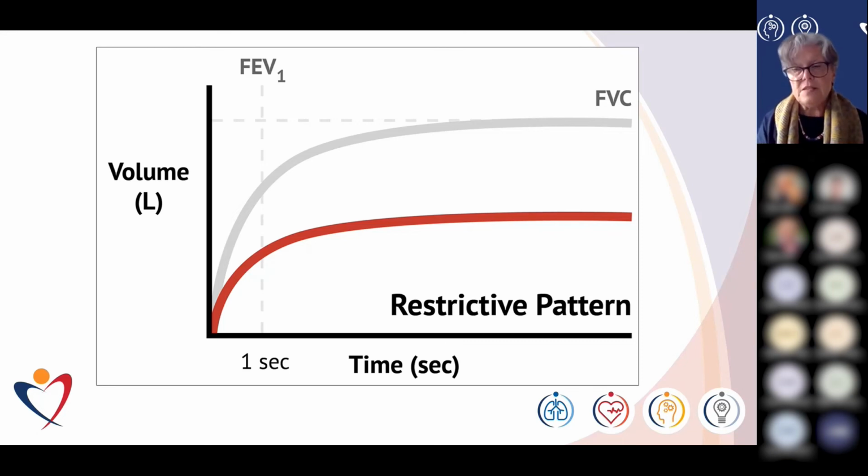We'll often see this pattern in patients who have severe COPD. So your spirometer might show obstruction with superimposed restriction, or it might show combined pattern, whichever monitor you're using, but they both mean the same thing. And that's often seen in patients with severe COPD.